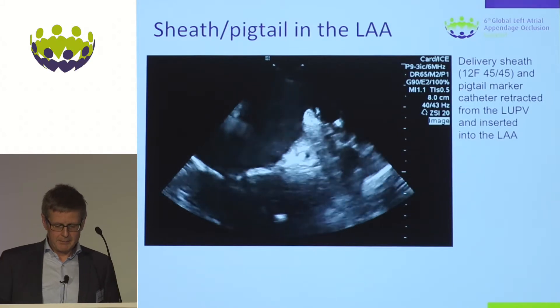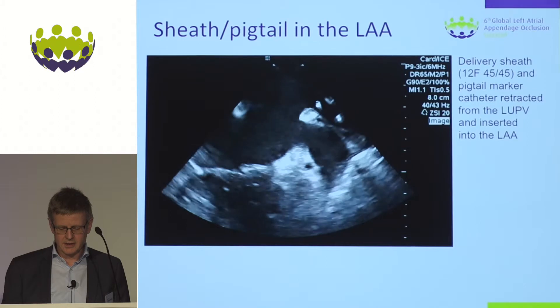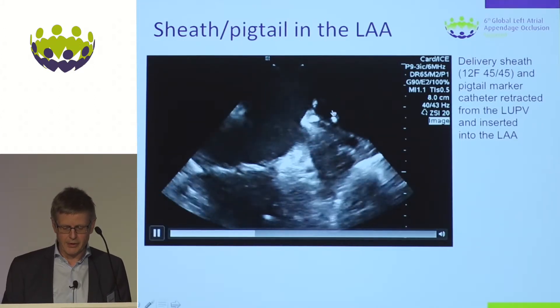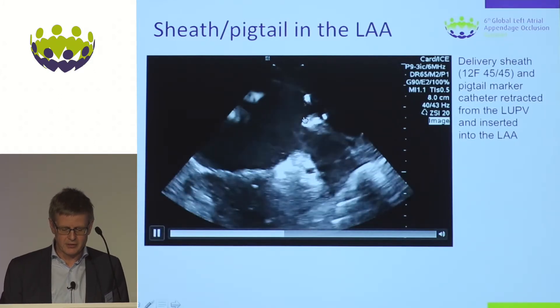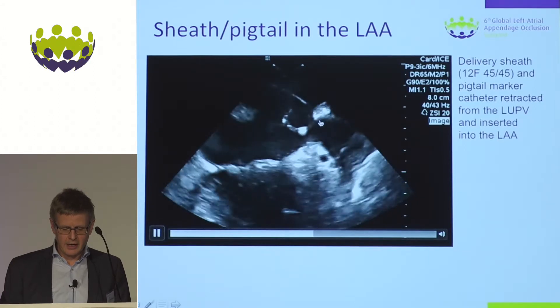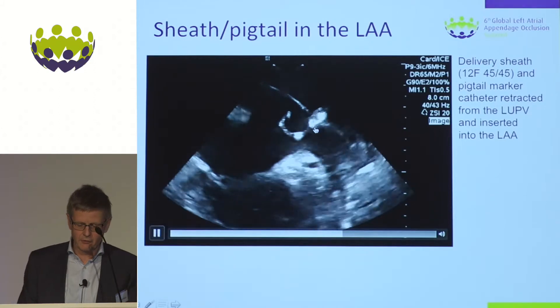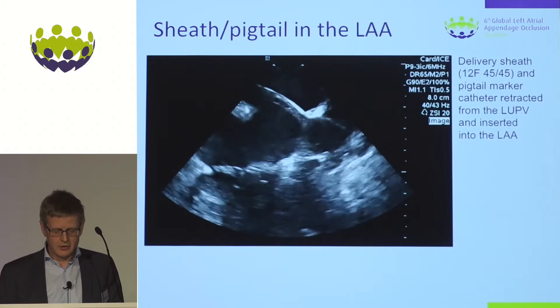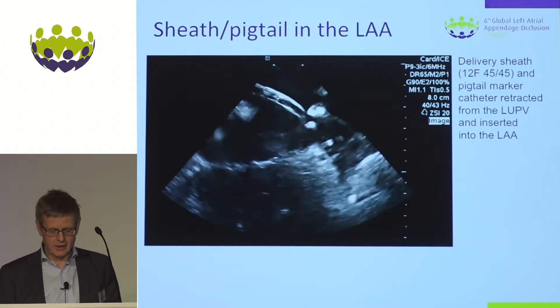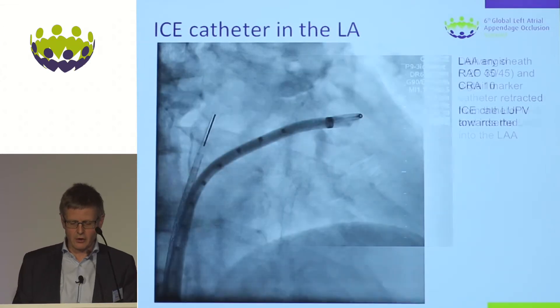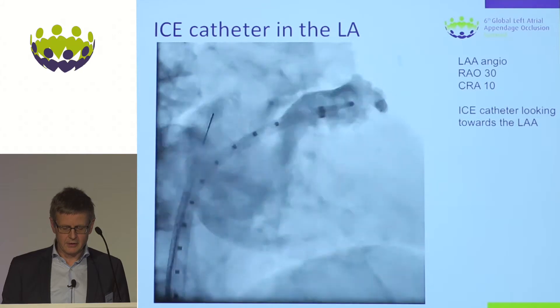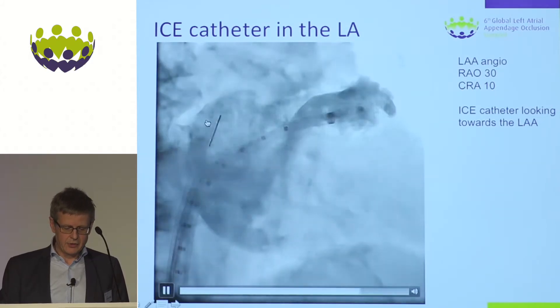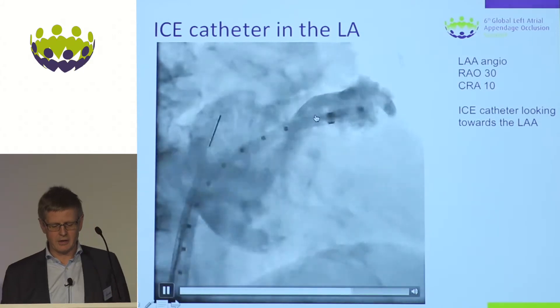I then place a pigtail marker catheter through the delivery sheath into the upper pulmonary vein and slowly retract it, easily following on ICE as it drops down to the upper pulmonary vein ridge and lands in front of the left atrial appendage. I prefer a pigtail because it is a soft structure, not a stiff sharp wire. I advance the pigtail into the left atrial appendage and the sheath follows. The ICE probe is positioned at the entrance of the left upper pulmonary vein, giving a clear view of the left atrial appendage and confirmed by angiography.